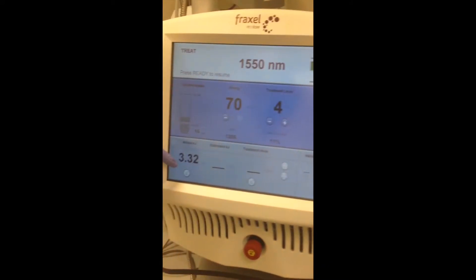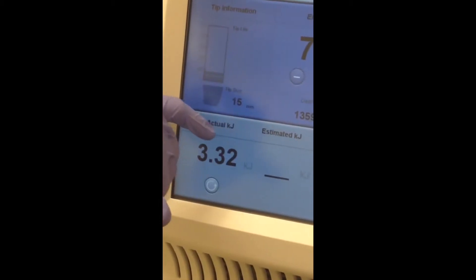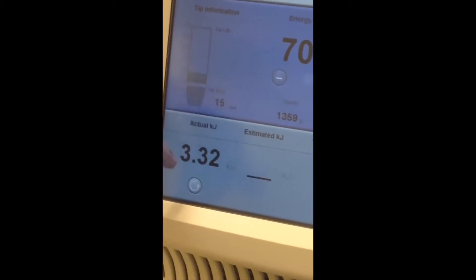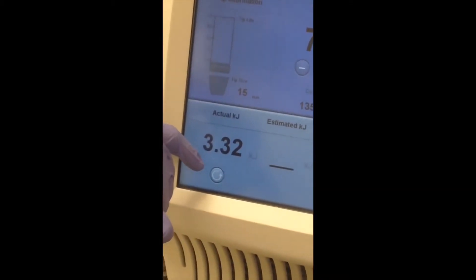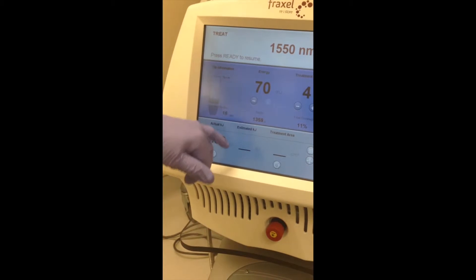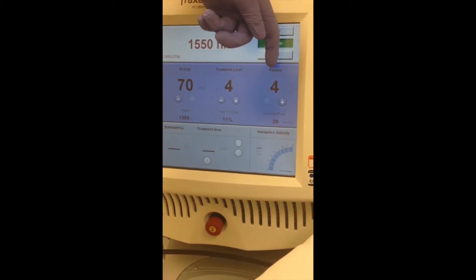We have used 3.32 actual kilojoules on the patient. This is a very relevant figure to write down in your chart notes — 3.32 kilojoules, 70 millijoules, 11% density, given over four passes. Obviously if you give six or eight passes, it'll actually be 22%.